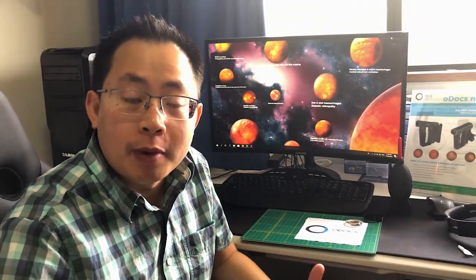I've been asked a lot lately about how to perform an examination with retina using a 20D lens and a smartphone, so I thought it would be good to make a video on this topic specifically to address this question.